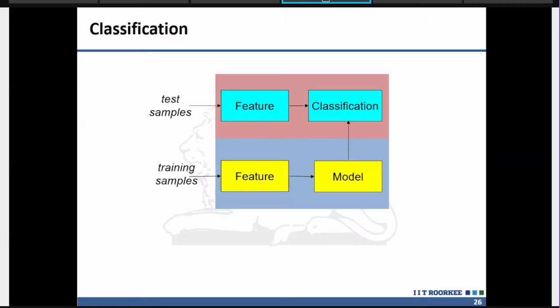So that's a simple machine learning paradigm. If you do not want to use feature extraction, you may use a deep learning paradigm like a recurrent neural network, BLSTM, long short-term memory, LSTM, and then GRU. All these frameworks are available, which do not require explicit feature extraction. You just provide the signals, and this will create the model for predictions.